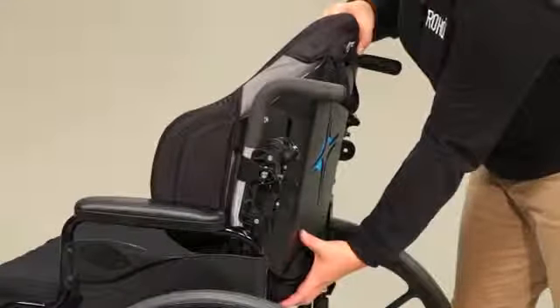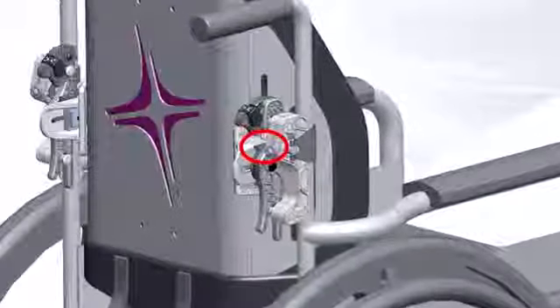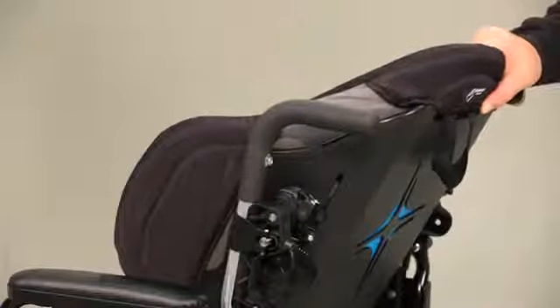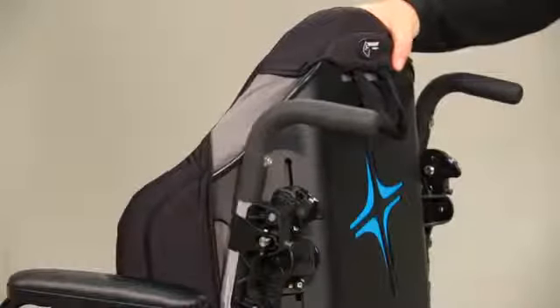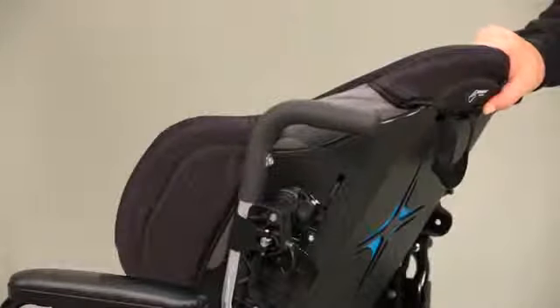Make sure the depth positions on the left and right sides are equal by comparing the markers on the top of the triangle brackets. To adjust the angle, pivot the back shell anterior or posterior until the desired angle is achieved. Tighten right and left depth and angle adjustment bolts with the Allen wrench until snug, plus a quarter turn. Clamp it, tighten it, and you're done.